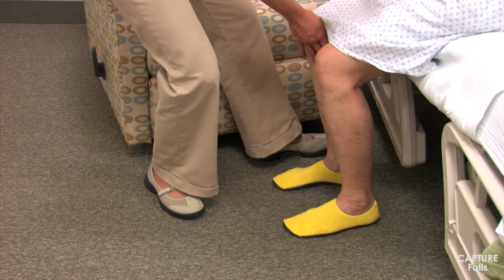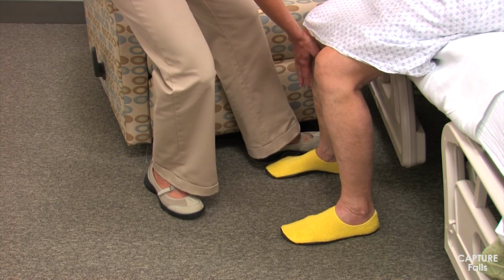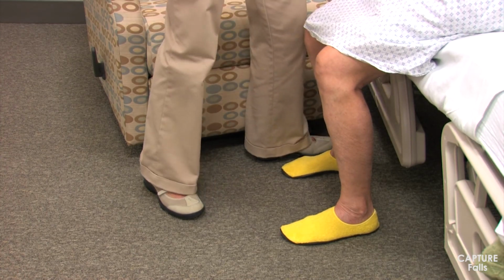If the patient has one leg that is stronger than the other, it might be helpful to have the individual pull the stronger leg back relative to the other one so that it is closer to the bed prior to standing. This position allows the stronger leg to raise the body most effectively to a standing position. Both feet should still be shoulder width apart.